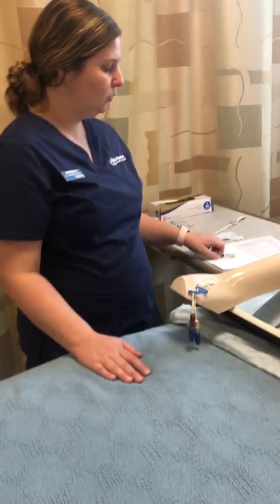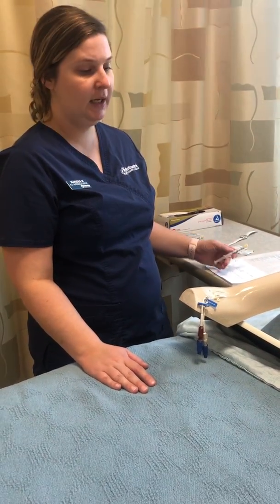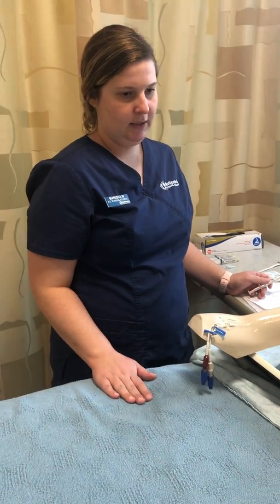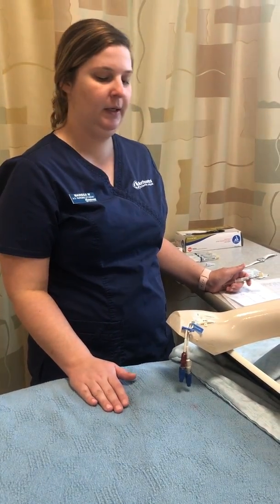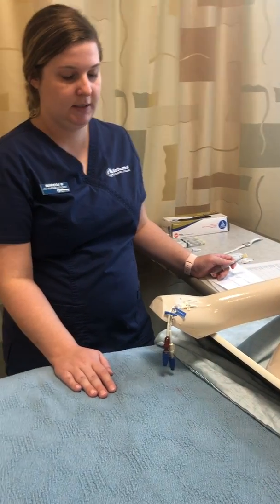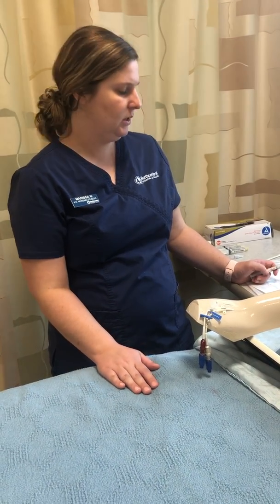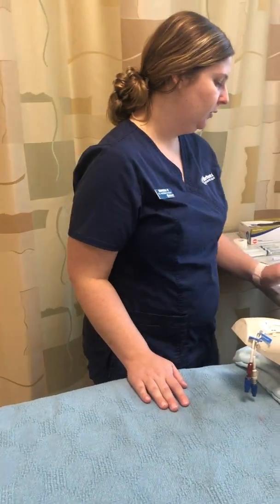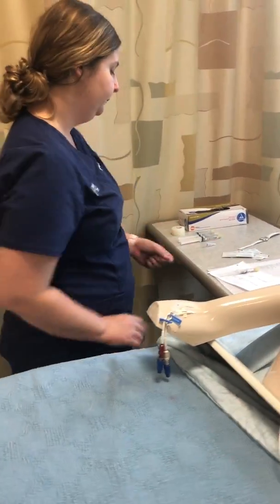And I'll say, okay, so the medication I have to give you today is the lorazepam for the anxiety that you're experiencing. And he says, okay. And I said, have you ever had lorazepam given through your PICC line before? And he says, yes, he has. And I said, okay, so you understand that this can cause a little bit of drowsiness or sleepiness, and yep, he understands. So then I'm going to go ahead and get my supplies ready here.